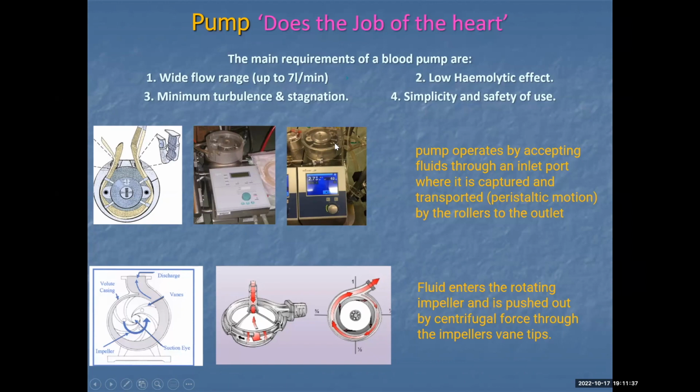The problem with this is you experience something called spallation, where particles of that tubing can break off into the circuit, which isn't great. Hopefully there are filters in the system that will catch this. The other thing is, if you think about that roller pump pressing on the components of the blood, red blood cells, platelets and so forth, for a short term it's not a bad idea. But with longer bypass times, all those components will be affected by some degree of damage. So it's not ideal.